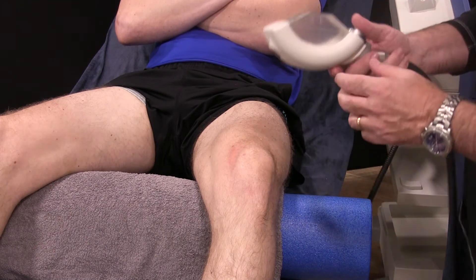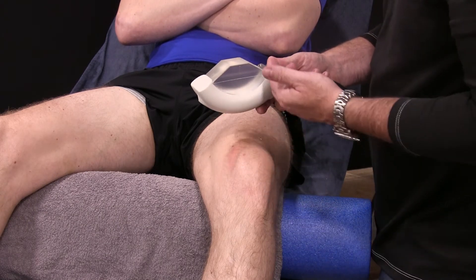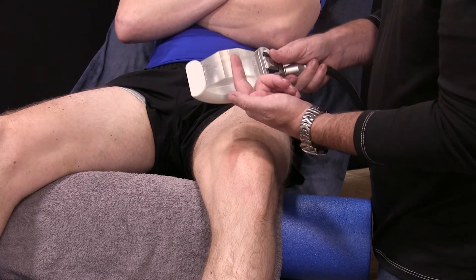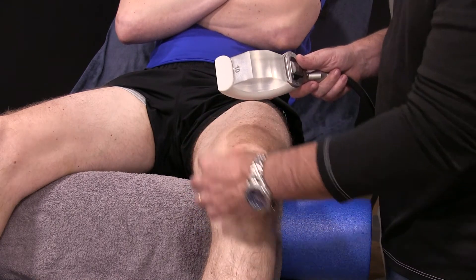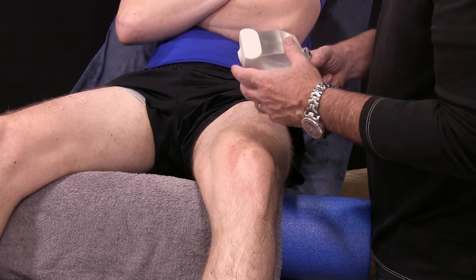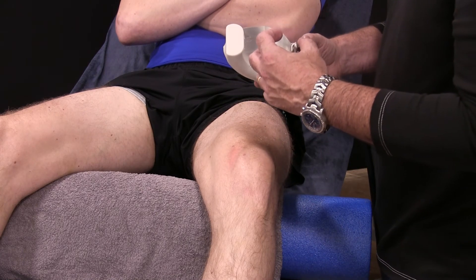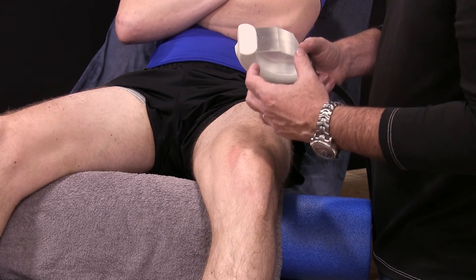The difference between this focused system and traditional focused shock waves is that it also has a linear component. We can use a circular pinpoint applicator or a linear one, which allows us to create a unique cigar-shaped blade of acoustic pressure. This can be used as a very deep form of soft tissue massage to reduce adhesions or decrease pain from tendinopathy. Most specifically, the acoustic application allows us to get within the joint, so we are truly intra-articular in terms of how we are treating pain.